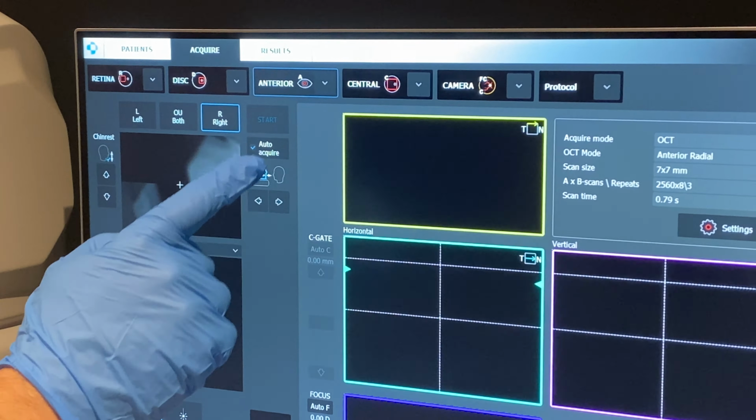So it might be you'd want to send that to a colleague for a second opinion or send to a hospital for referral. So whether you're in this rendition window or the previous window, output's always available top right. So if I click output, I can select PDF report and OK.